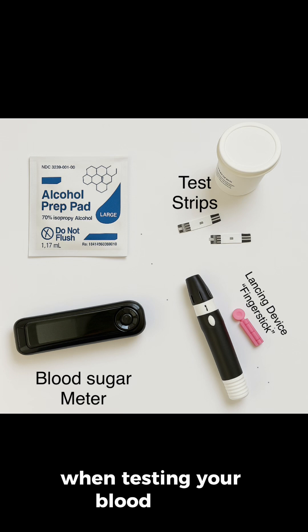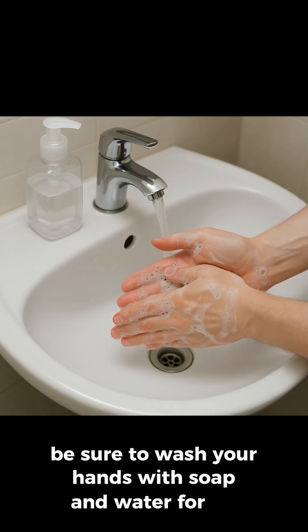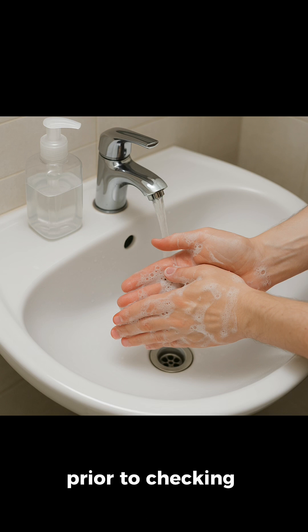When testing your blood sugar, you want to make sure everything is prepared. Be sure to wash your hands with soap and water for at least 20 seconds prior to checking your blood sugars.